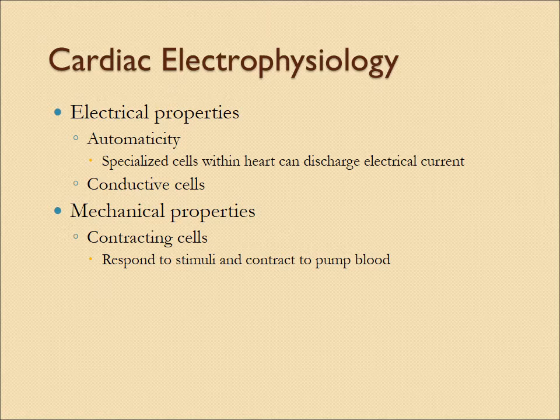We need the electrical system working well, and we need the pumping structure working well. When we're analyzing ECGs, we're predominantly looking at that electrical force. It's telling us how the electrical current is going through the heart.